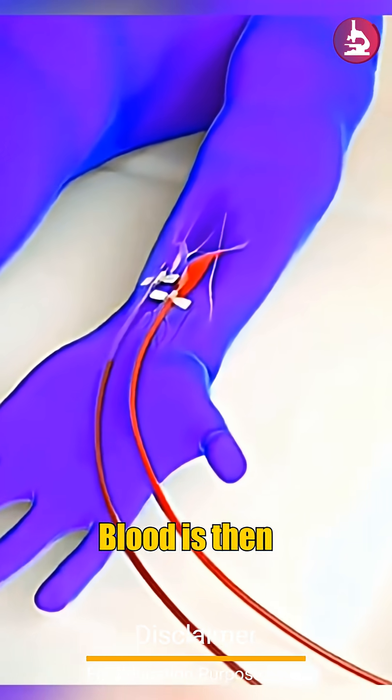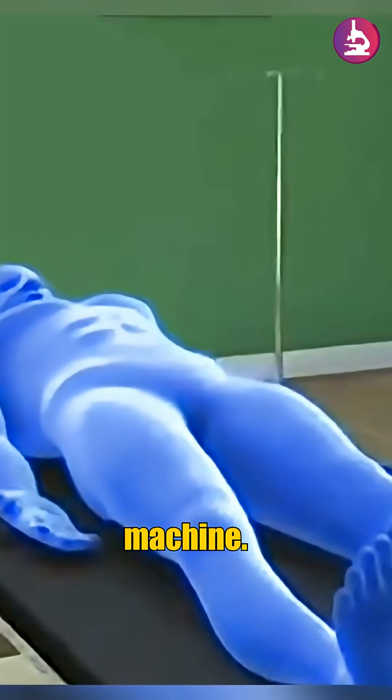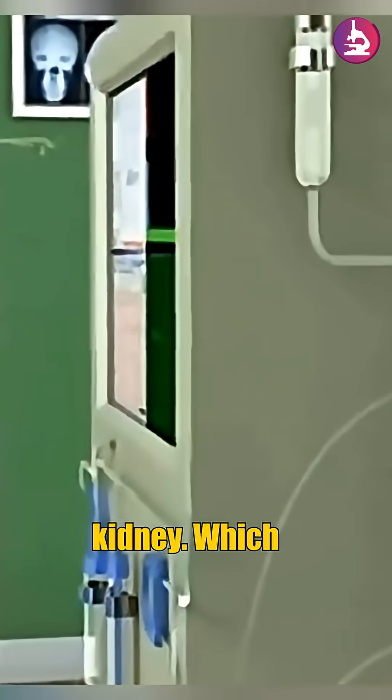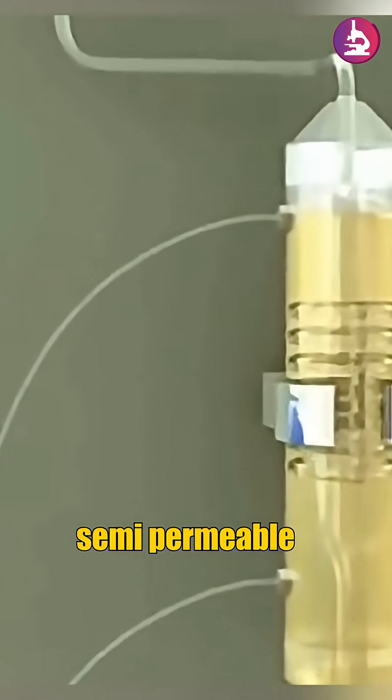Blood is then withdrawn from the body and directed into a dialysis machine. Inside the machine, the blood flows through a dialyzer, often referred to as an artificial kidney, which contains a specialized semi-permeable membrane.